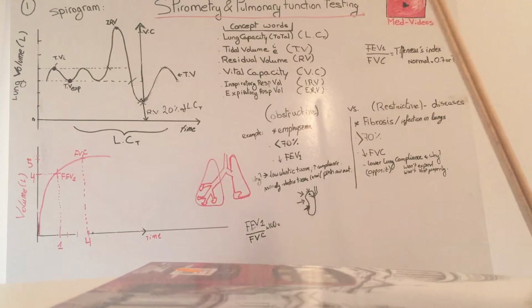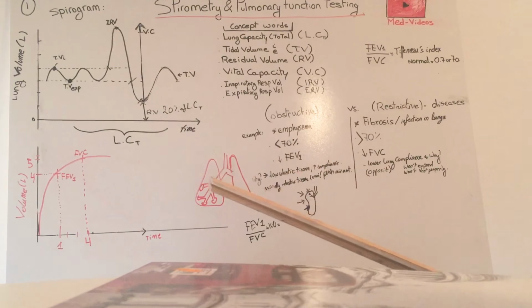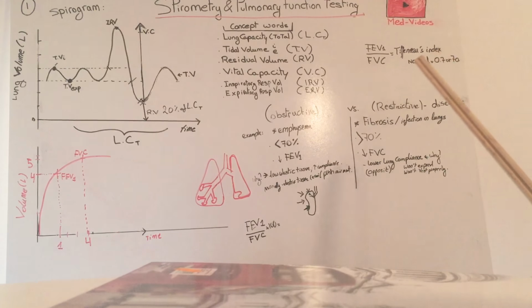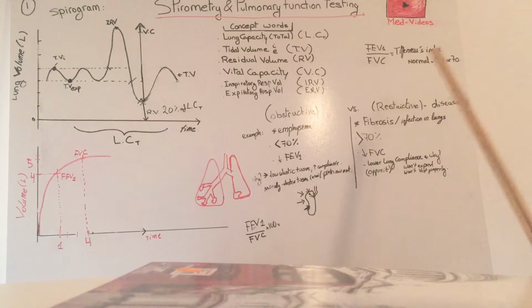Now, as I said before, the FEV1, which is about 80% in normal healthy patients, or 70%, there's always going to be that 10% standard deviation depending on the age of the patient and the size, etc., like how big these people are. This will be your Tiffeneau index, okay? The 70 is the ratio between the FEV1 and the forced vital capacity. Now, depending on whether you have less or more, it will tell you the bracket of pulmonary disease that your patient will have.